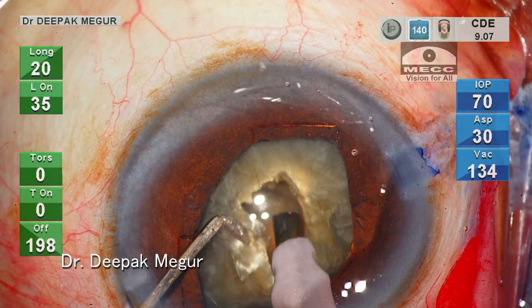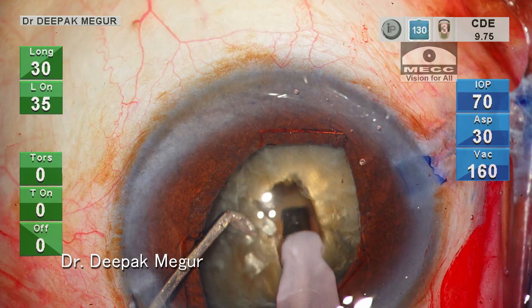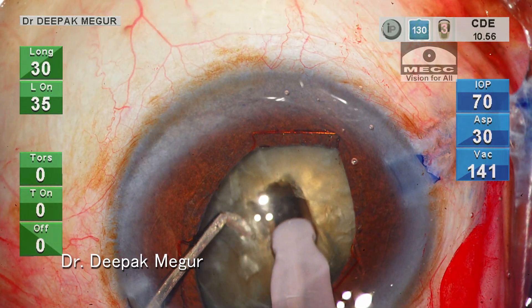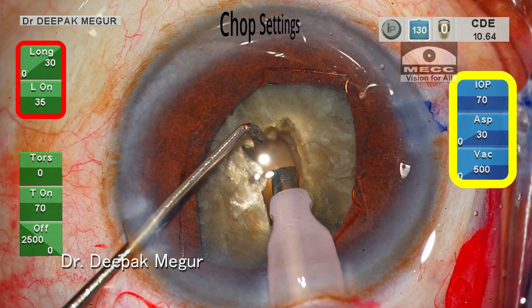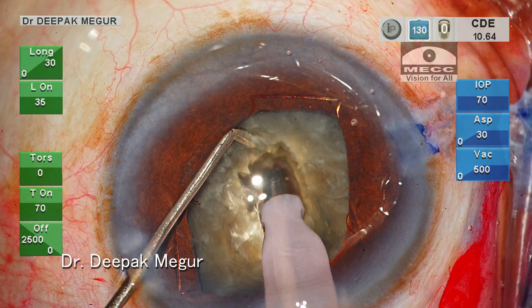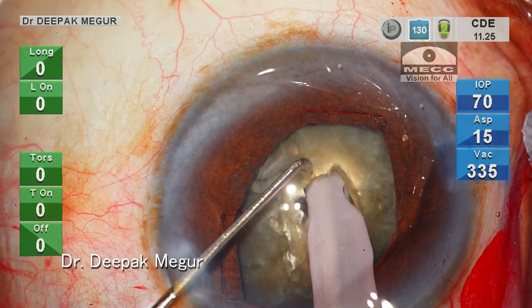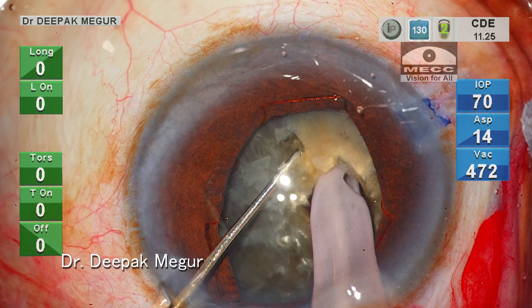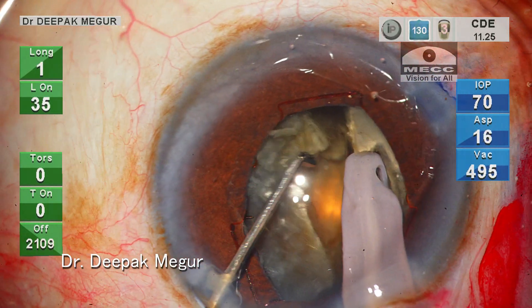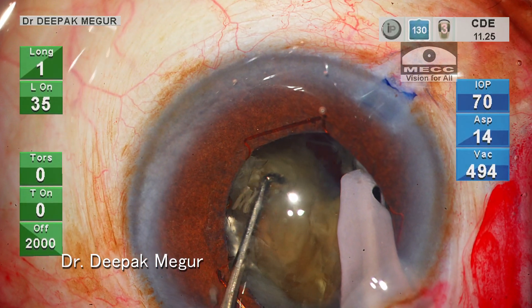This groove is going to give me a nice grip to hold the nucleus for performing the vertical chop. I've changed my settings to chop mode. I'm using only longitudinal phaco in burst mode along with high vacuum. The initial burst of energy allows me to bury my tip deep into the substance of the nucleus, and then my sharp chopper moves vertically down and then laterally at progressively deeper planes.